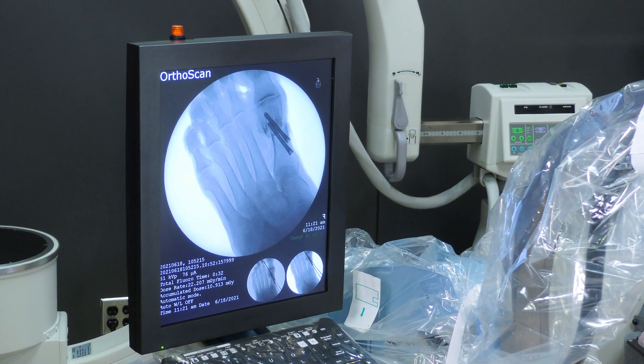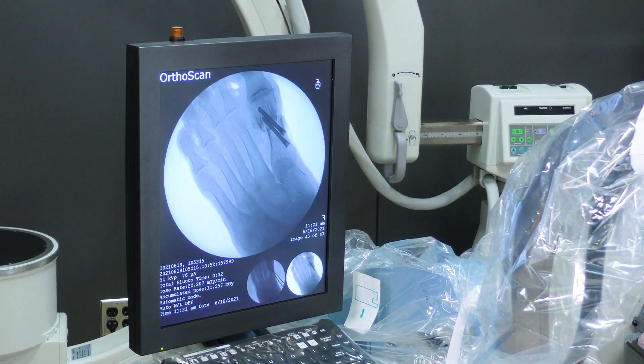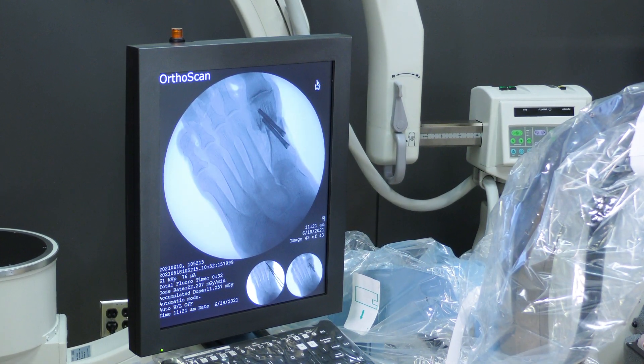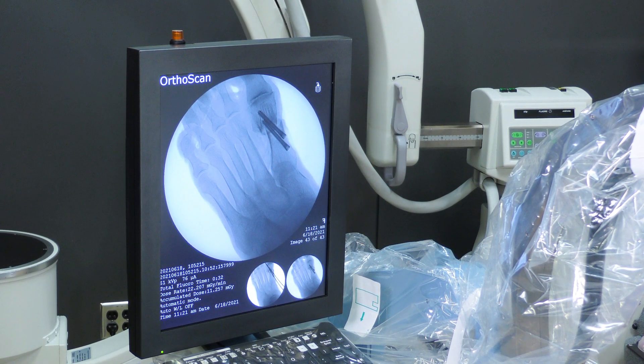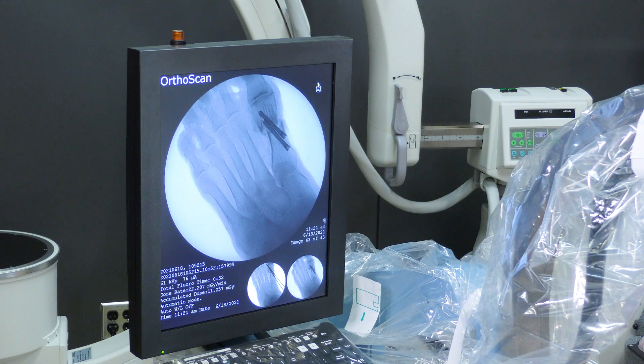We'll take an x-ray. As you can see, the metatarsal head has been shifted over laterally, we've got two screws in for fixation. I then go in with a saw and remove this redundant shelf.